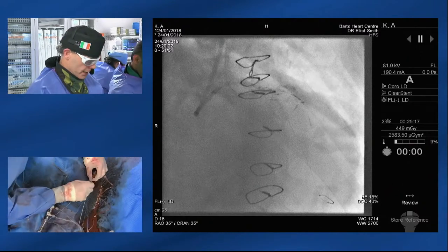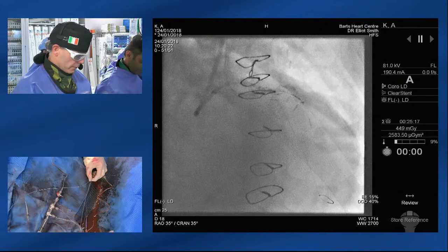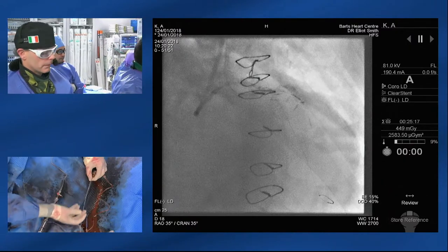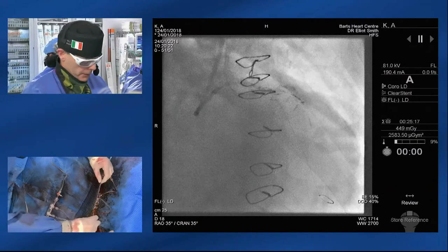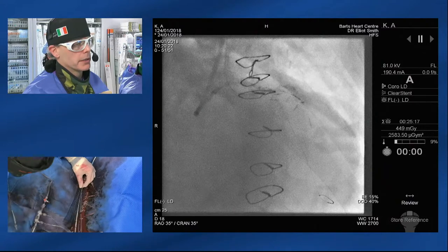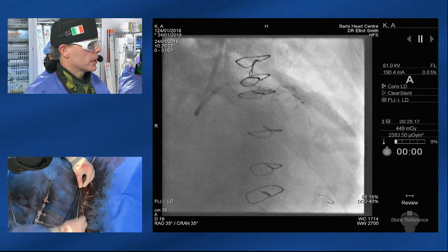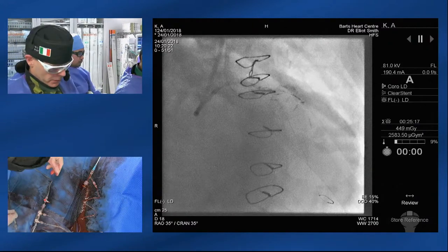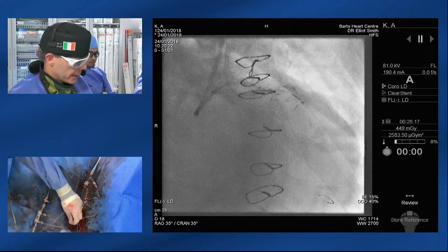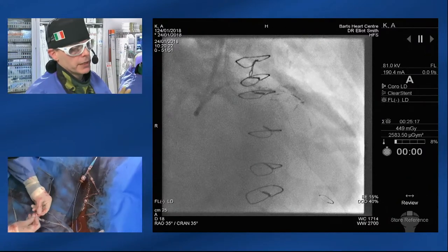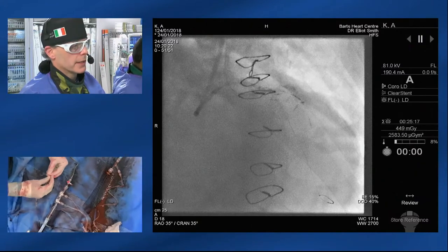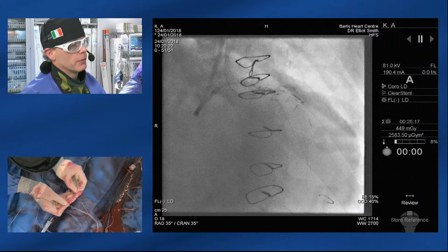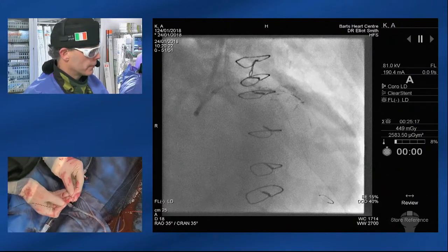Once we balloon across the distal CTO cap, Elliot's going to take the retrograde equipment out and we're basically just back to careful angioplasty. At this stage we want to be absolutely meticulous to get a good long-term result for this patient — that's going to involve intravascular ultrasound assessment and careful assessment of the proximal LAD. We think we've troubleshooted most of the anticipated problems. We're not going to let our guard drop until we've got a great result for this gentleman.